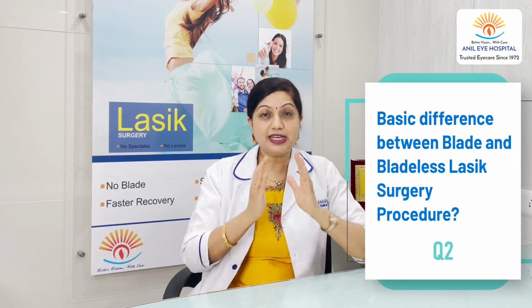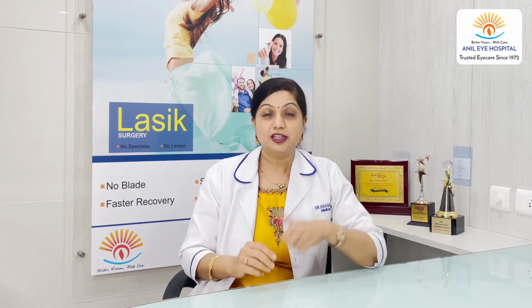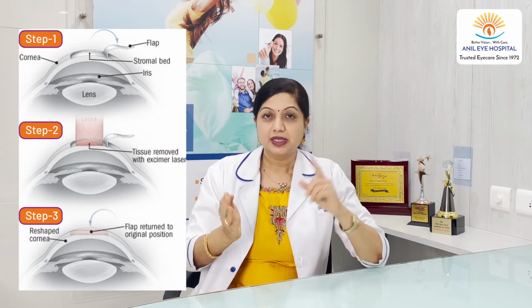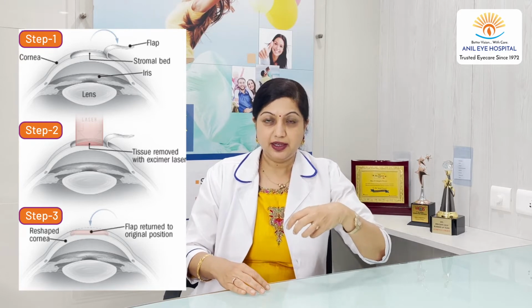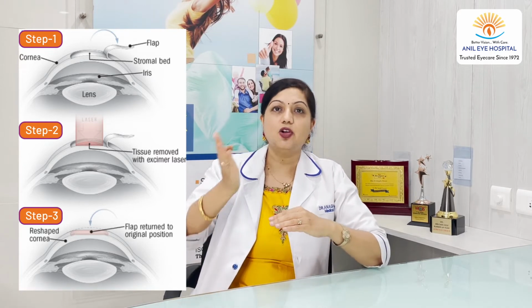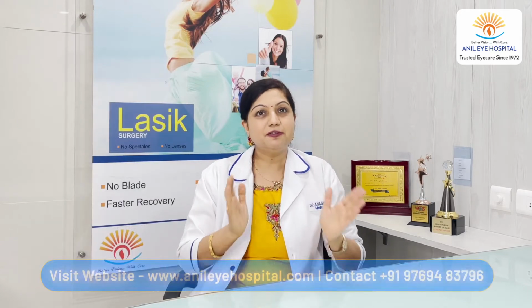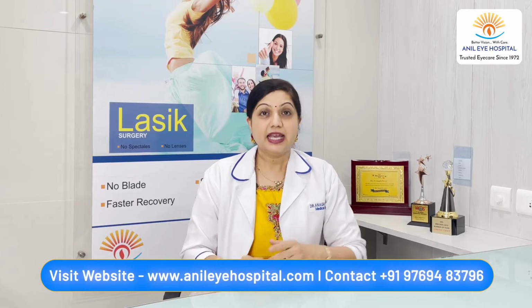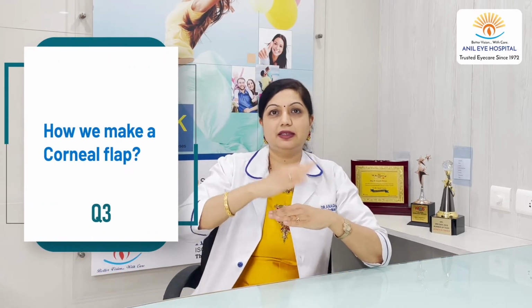For this, we need to understand that there are 3 steps in LASIK surgery. The first step is the making of a corneal flap. The second step is laser that is put on the eye. And the third step is the corneal flap that is put back on the eye. Now the basic difference between a blade and a bladeless LASIK is in step number 1. That is how we make the corneal flap.